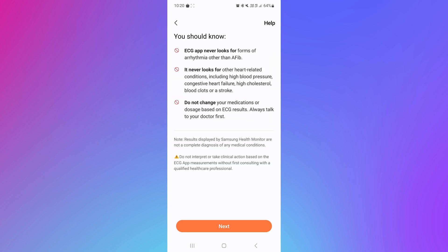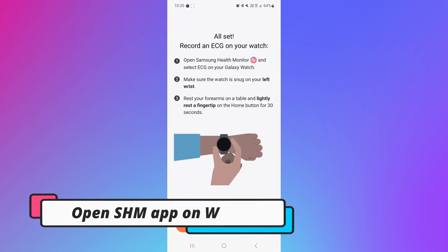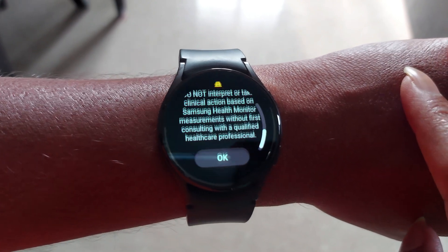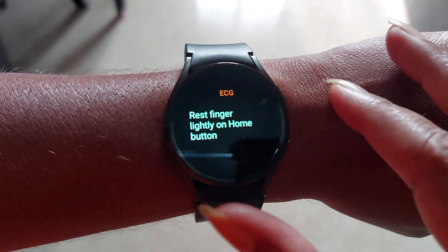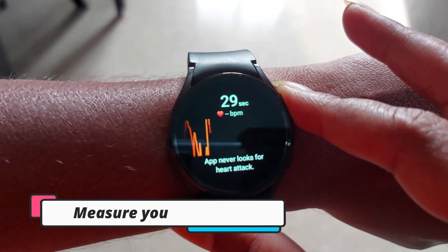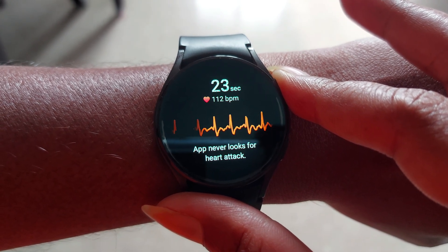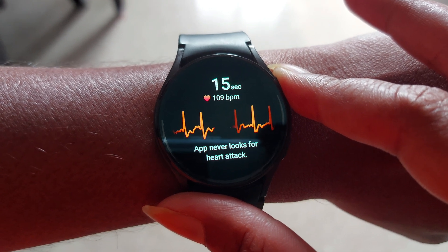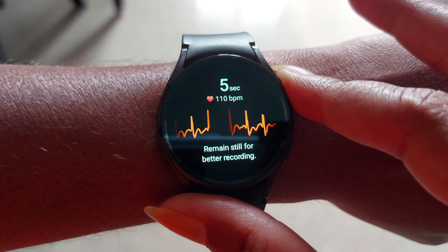Fill in the details one by one, then come back to the smartwatch. Open the app and click on any measurement like ECG. To measure ECG, wear the watch, click on ECG, put your finger on the power button or home button, and wait for 30 seconds. It will give you the final result.